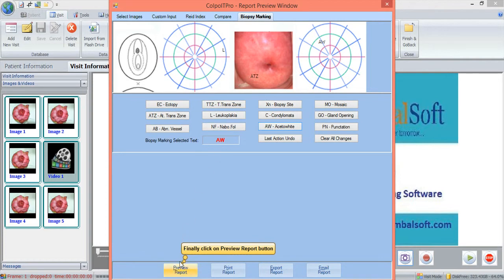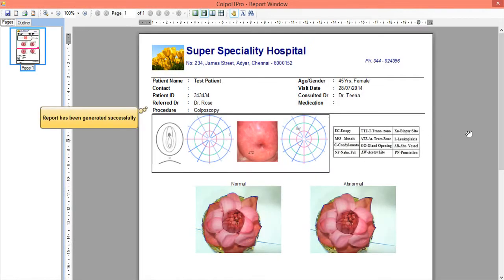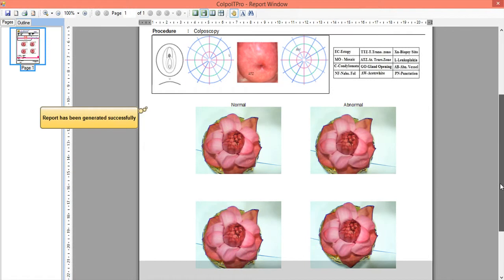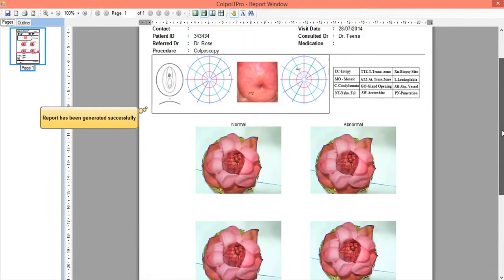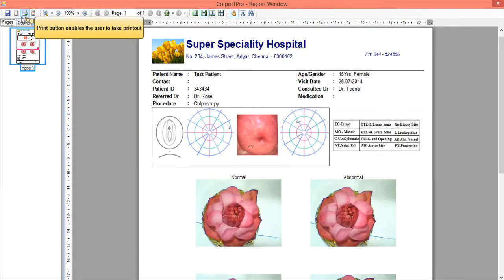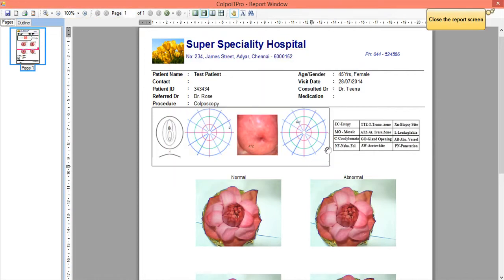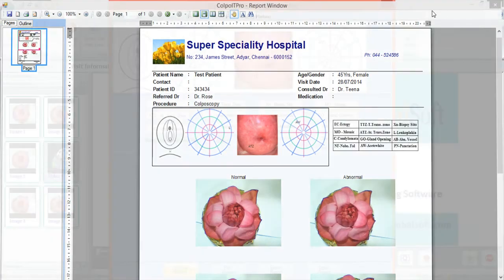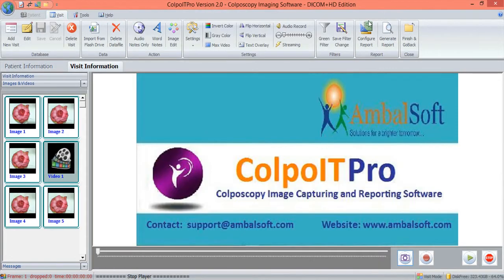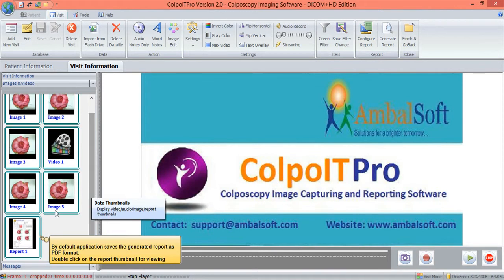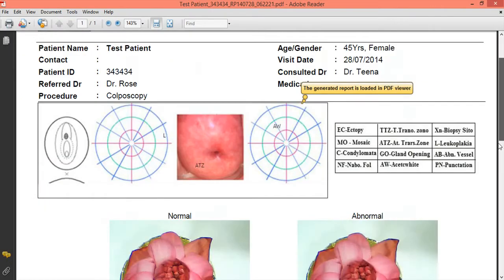The final report with the captured images, biopsy graphs, and other conclusions is generated and is ready for print. The application saves the generated report as a PDF file. Double click on the generated report thumbnail to view it.